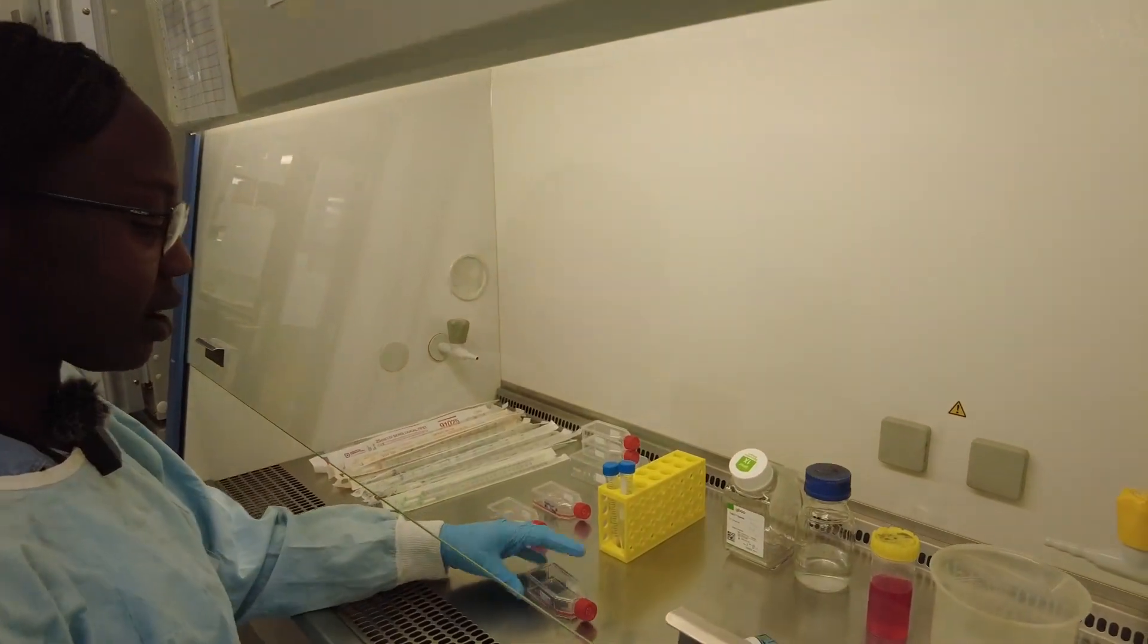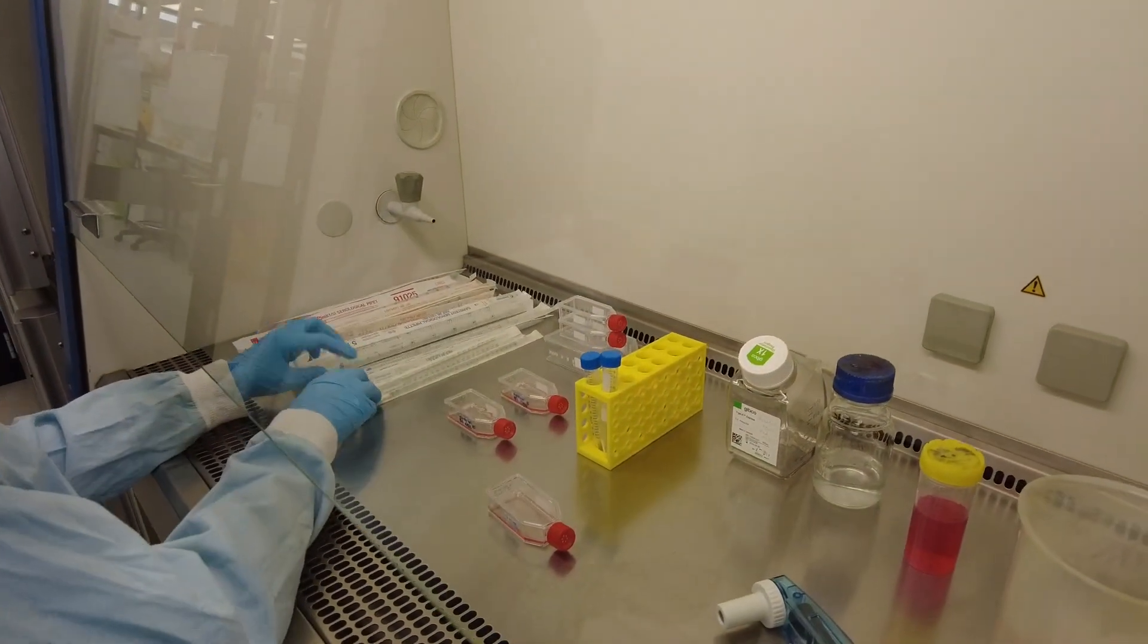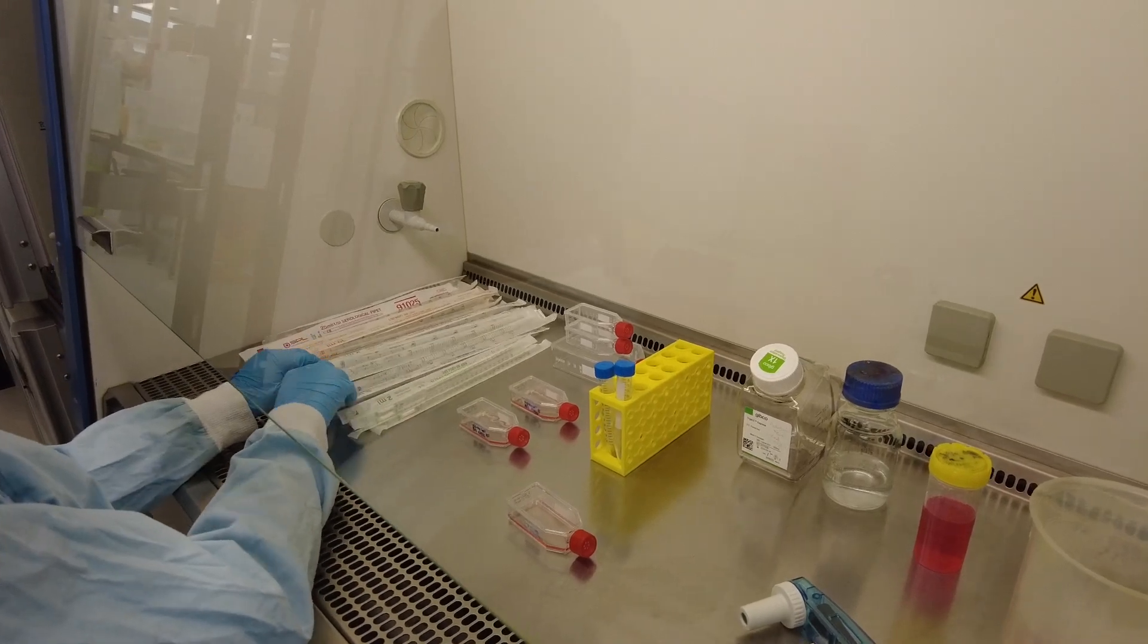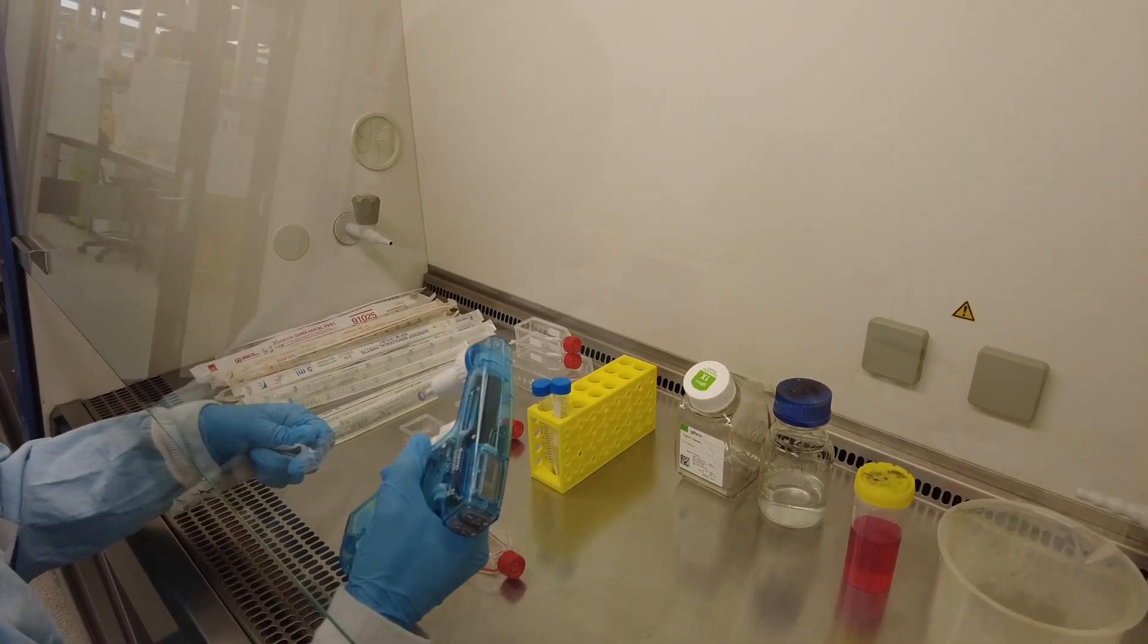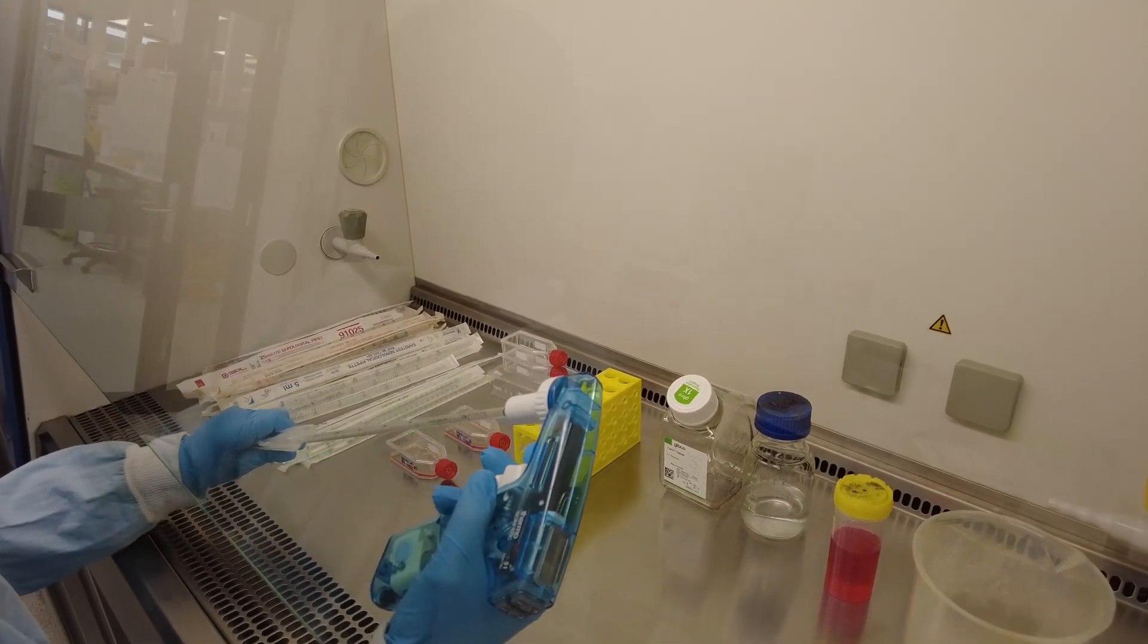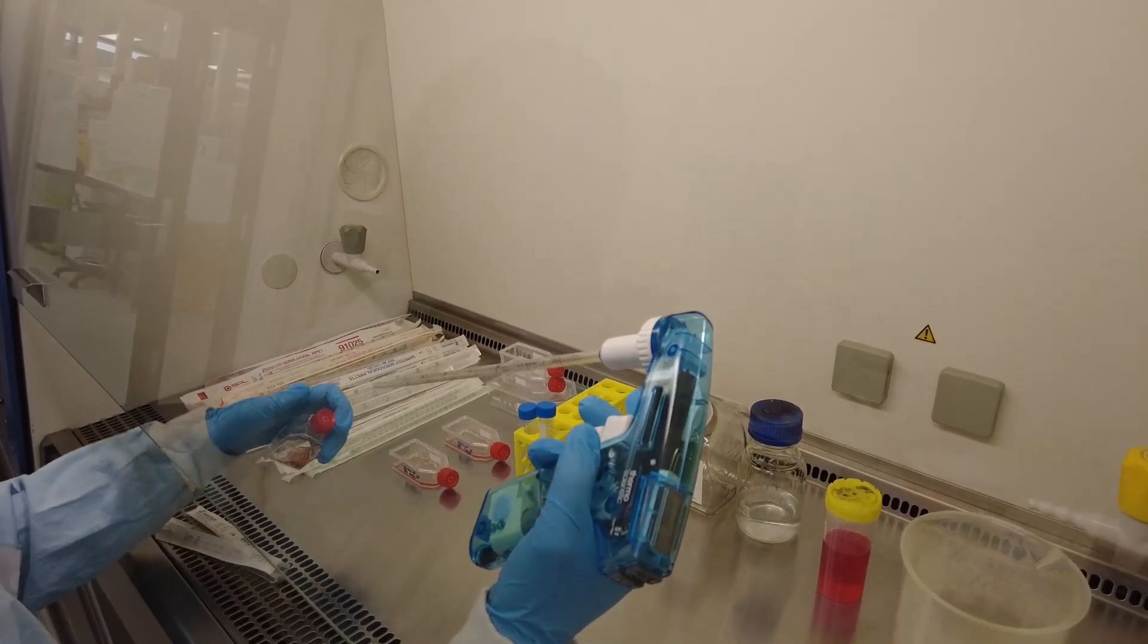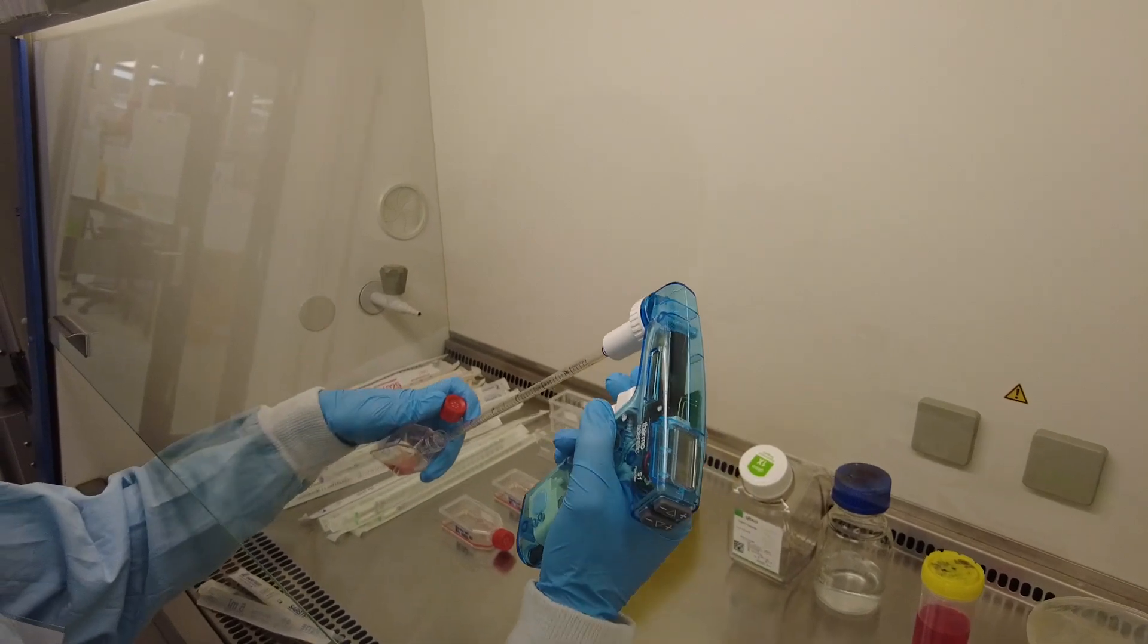So this is our backup flask, there's only a few cells in there. I'm going to remove the media and just put fresh media in there, so that's very simple. So with a 5ml pipette and the pipette gun, we're going to remove the old media.